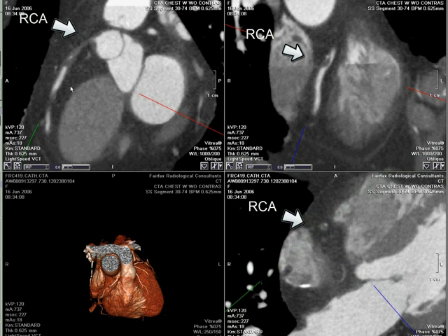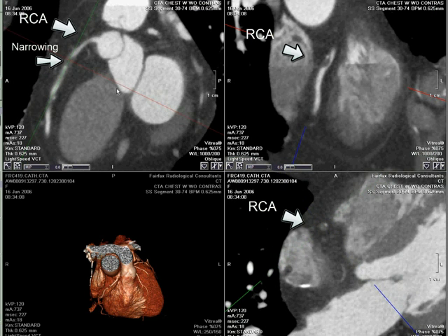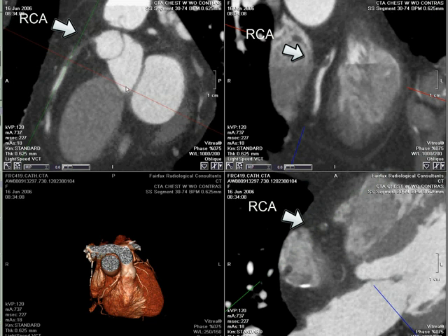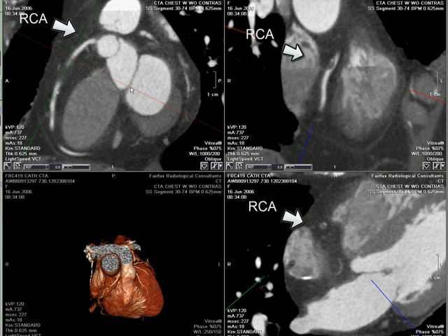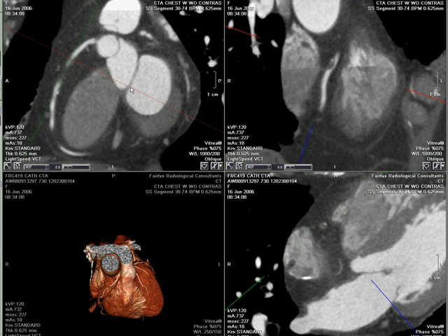Given these findings and the patient's history, this patient would be referred to coronary catheterization for possible confirmation and also for possible intervention. Thank you.